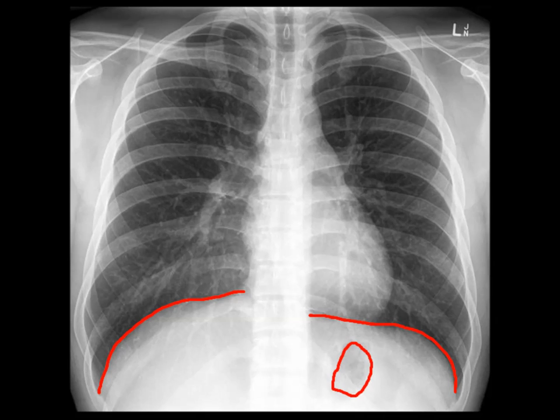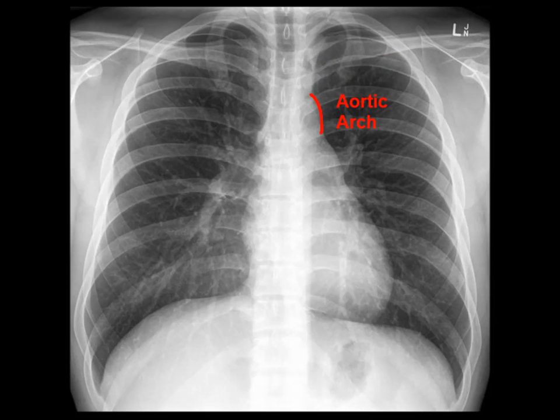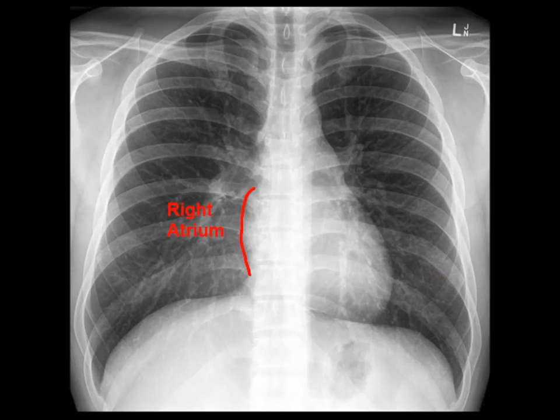Next we will look at the borders of the heart and major blood vessels, going clockwise from top to bottom. First you have the subclavian artery, then the aortic arch, the pulmonary artery, a small bit of the left atrium, the left ventricle, the right atrium, the superior vena cava, and the ascending aorta.